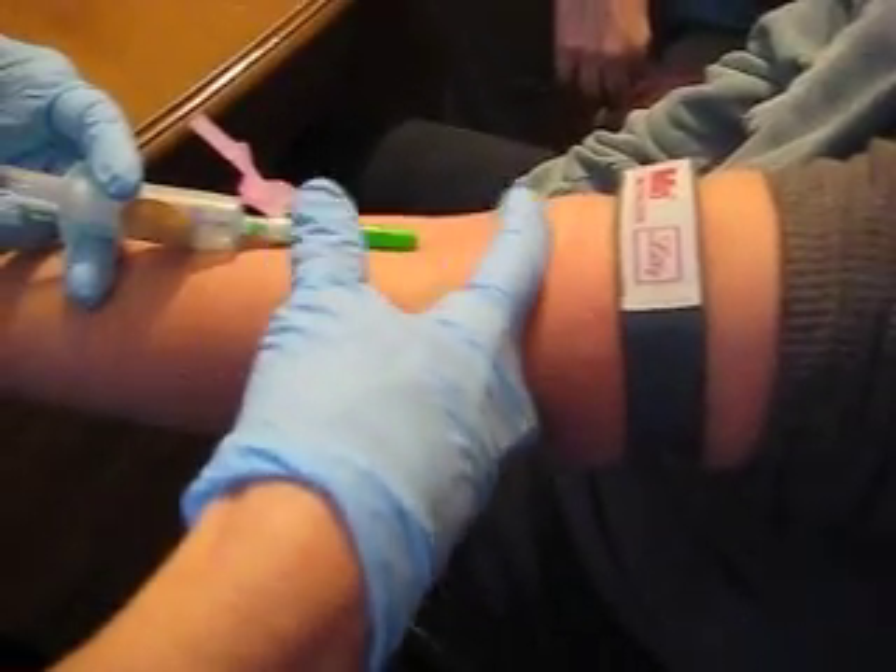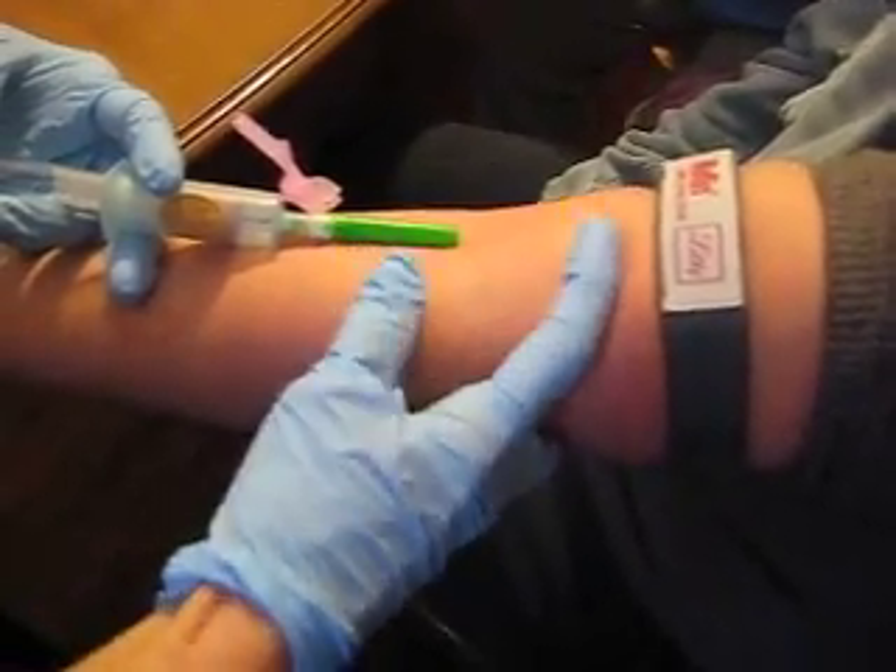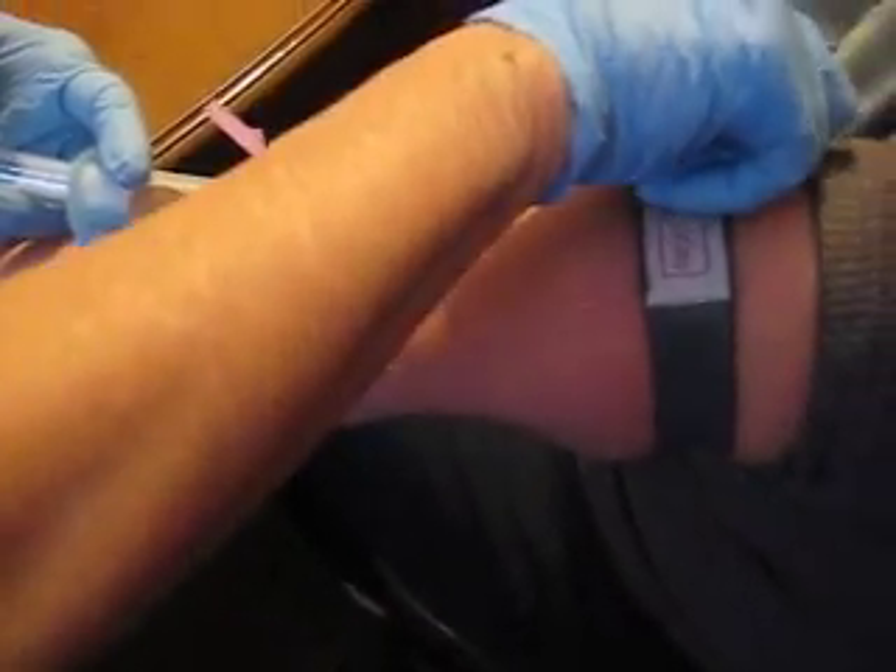If you put it on the vein, you're going to pre-compress it — occlude the flow — and you don't want that. So I'm going to let you take over here real quickly.